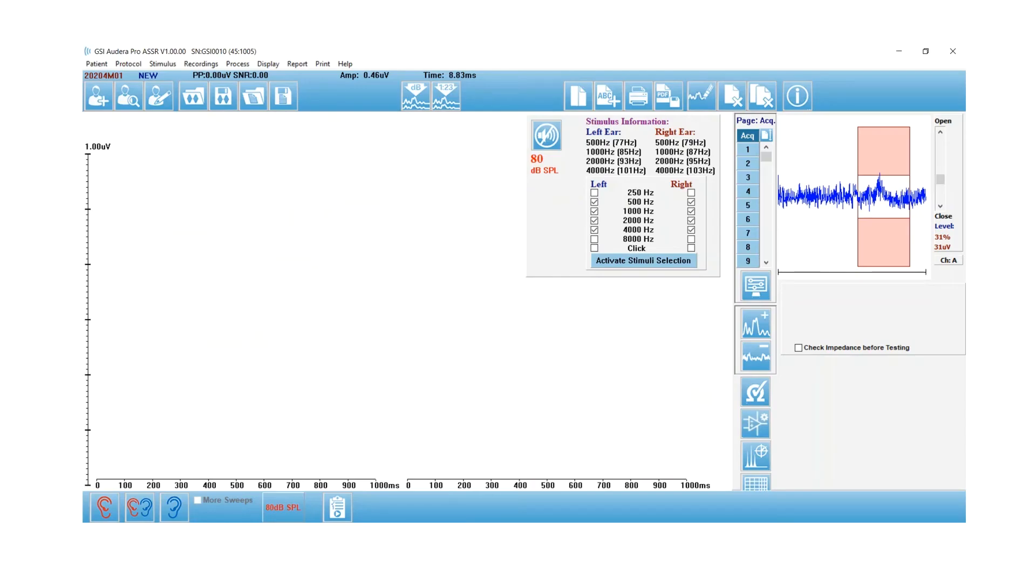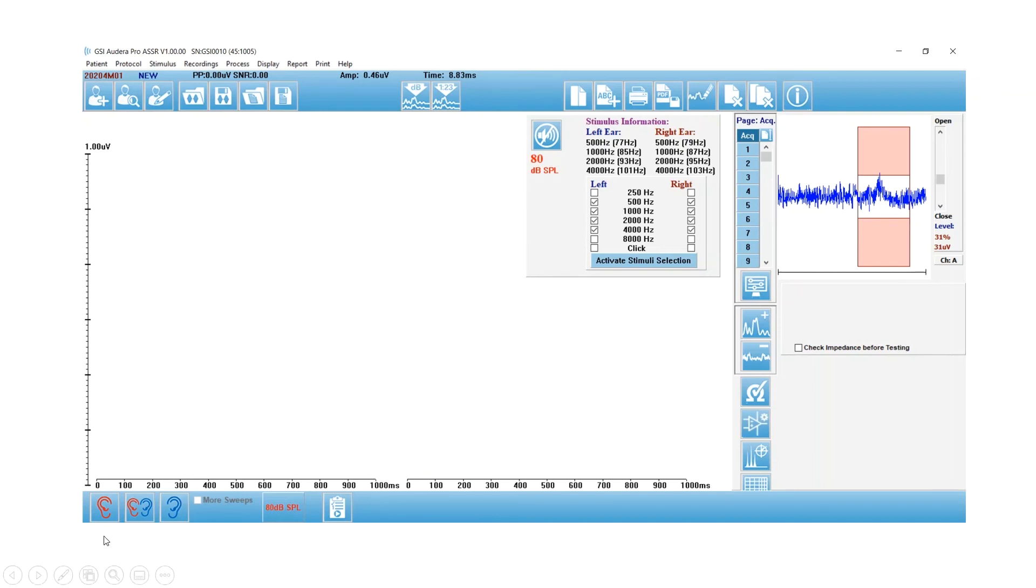Now I'm going to show you some recordings. I've done these in my own ear while I'm sitting up in a chair, so they're not pretty, but it will show you all the different screens that you need to know when you're collecting an ASSR.